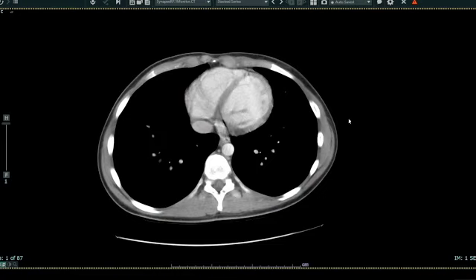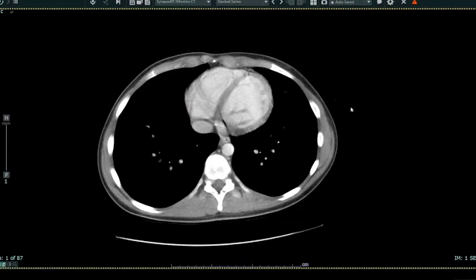Now the CAT scan in the pediatric patient. This is a 15-year-old female who came to us with a history of abdominal pain for about 12 hours. This is a routine study that we do — a CAT scan of the abdomen and pelvis. We inject a small amount of contrast intravenously, and the patient also drinks a small amount of contrast. We're very conscious of limiting that radiation dose to the patient.